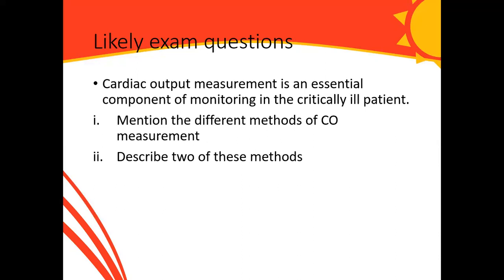All right, so we have come to the end of the lecture, and as a way of recap, we've looked at hemodynamic monitoring, its relevance intraoperatively, its relevance in the critical care setting. We have also looked at the different parameters that are measured or monitored. We talked about blood pressure, which can be measured with two methods, non-invasive and invasive. And I told you the different non-invasive methods: palpatory, auscultatory, tonometry, oscillometry.